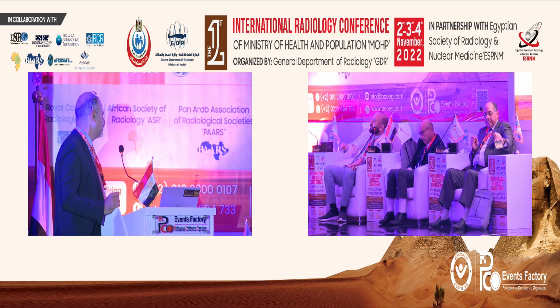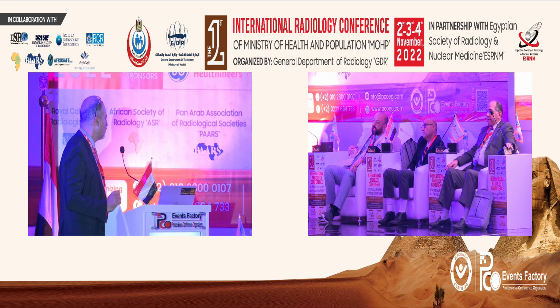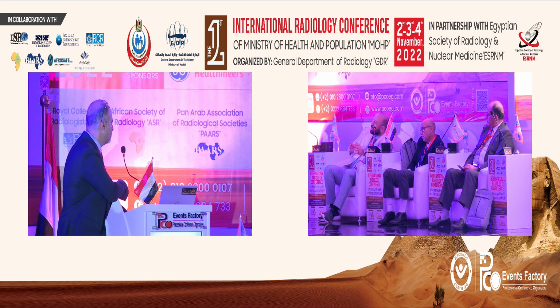I actually have a question about the reflux. Sometimes when we do abdominal ultrasound, you can't find the reflux in the gonadal vein, especially when it is circumaortic, for example. But the patient has pelvic congestion syndrome, and when we go with the catheter, when you go deep, it is totally refluxing. Are there any tricks or maneuvers to show the reflux in the vein in these cases? In the renal vein? In the gonadal vein.